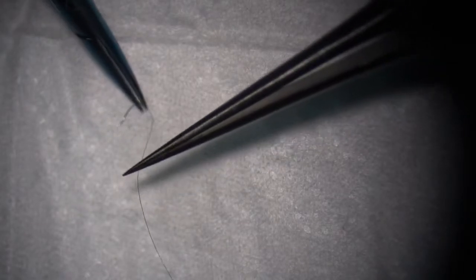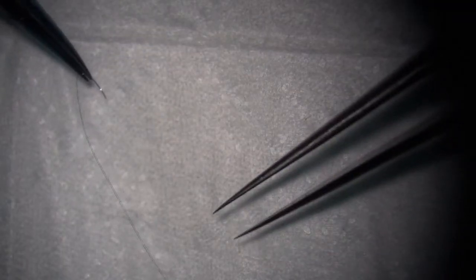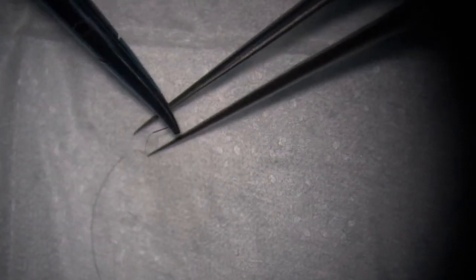And then also we may hold the needle with the backhand technique. Sometimes we hold the needle this way. If the vessel in the worst scenario is from the lower right to the upper left, that's the worst scenario. It's really hard, because we cannot turn our body to do surgery like that. So we can hold the needle this way. And now this stitching is like that. And pull the suture. See, I try to use one hand to pull the suture all the way out. All the way out, yeah.